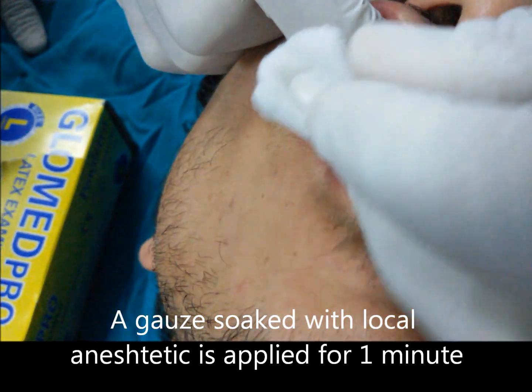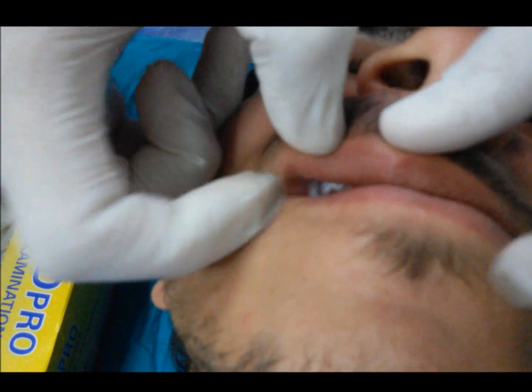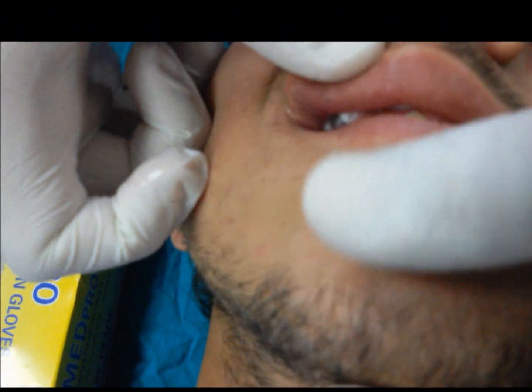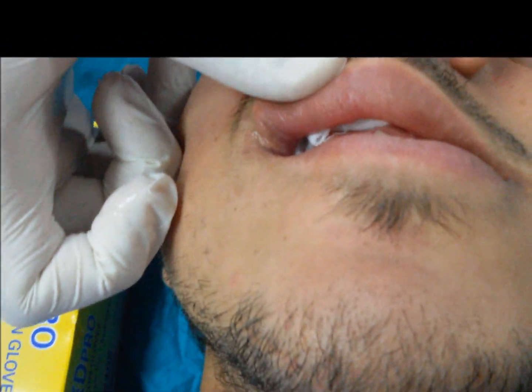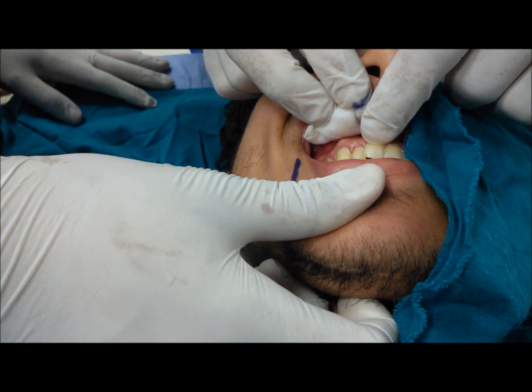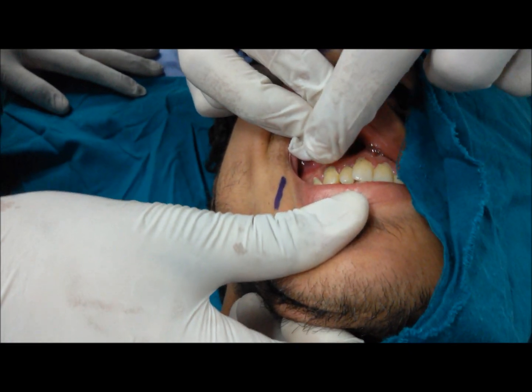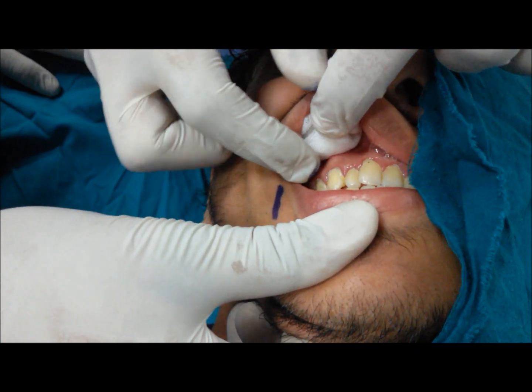A gauze soaked with local anesthetic is applied for 1 minute for topical anesthesia. Ask the patient to occlude his teeth to identify the landmarks: the upper central incisors, the canine, and the first maxillary premolar.